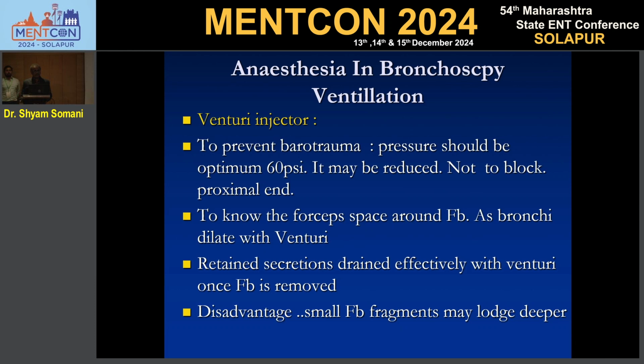Venturi is used to drain the secretions, because intermittent Venturi will drain out the retained secretions. The disadvantage of Venturi is that smaller particles may dislodge deeper, so at that time you should inform the anesthetist, please stop Venturi, I am going to catch the smaller particles.